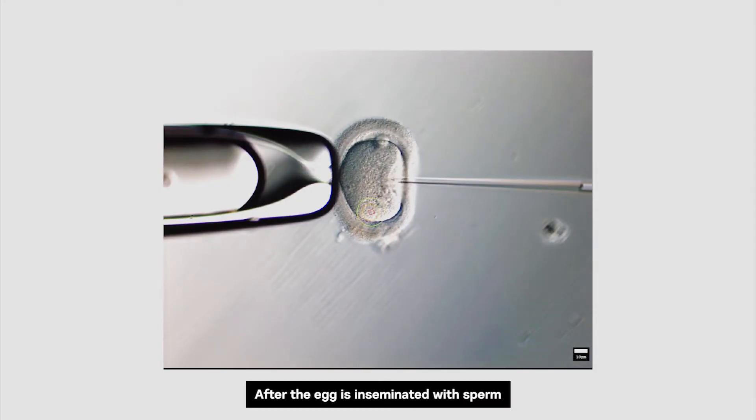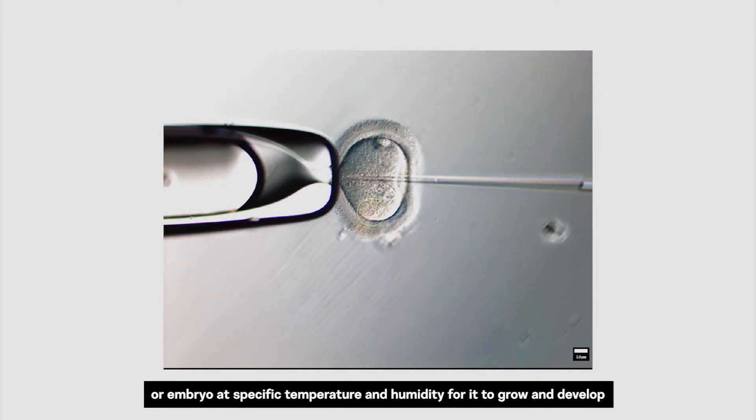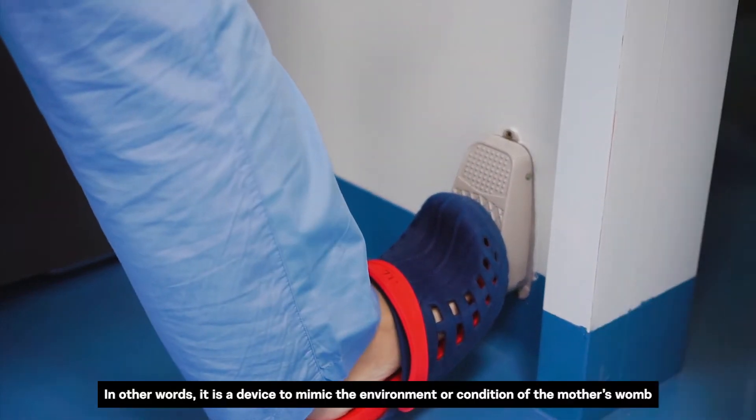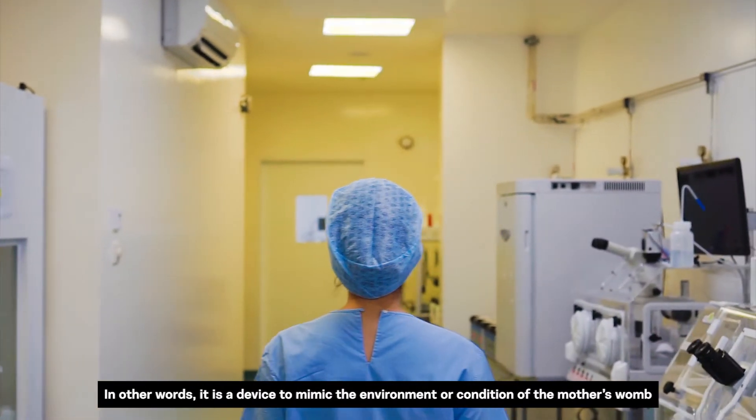After the egg is inseminated with sperm, we will then place the egg in an incubator, which is a device to incubate the egg or embryo at a specific temperature and humidity for it to grow and develop. In other words, it is a device to mimic the environment or the conditions of the mother's womb.